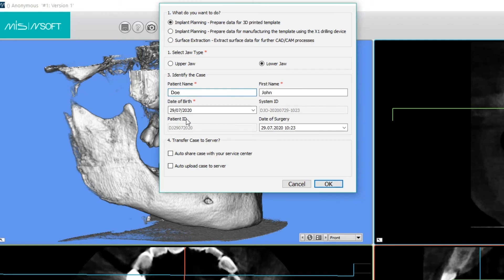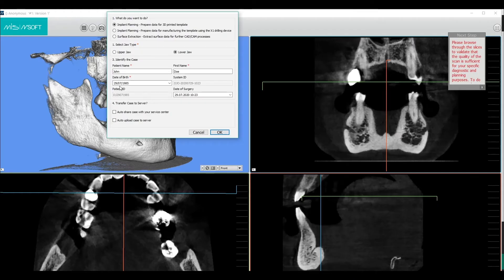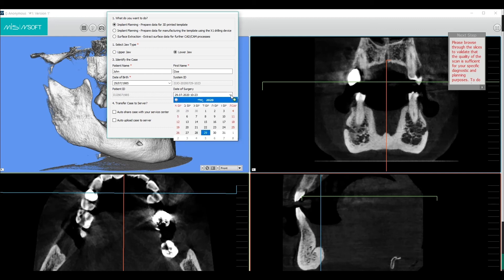Enter the patient's surname, first name, and third name. MSoft will automatically create the system ID and the patient ID codes. Fill out the surgery date from the drop-down box.